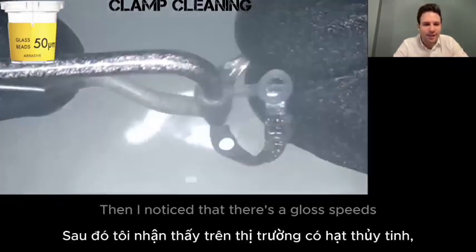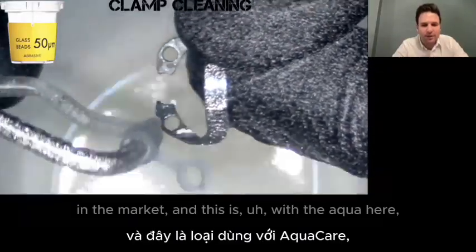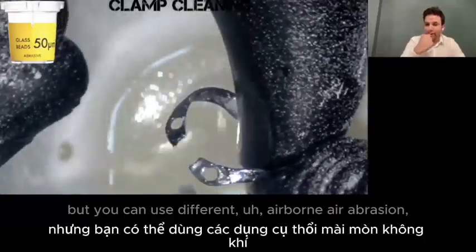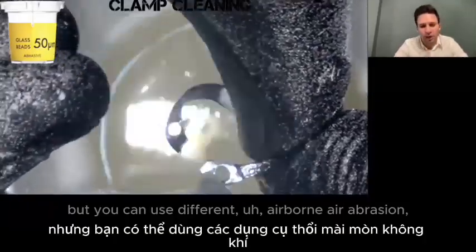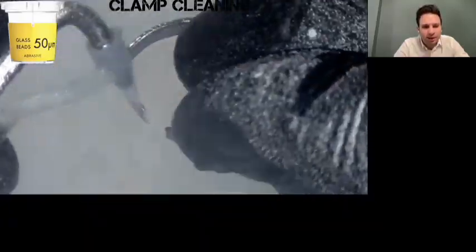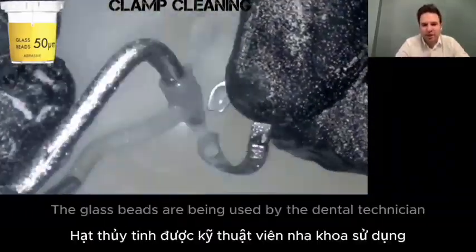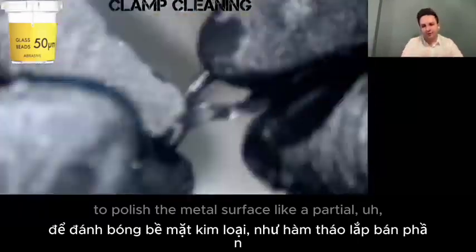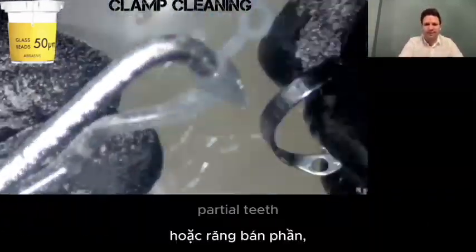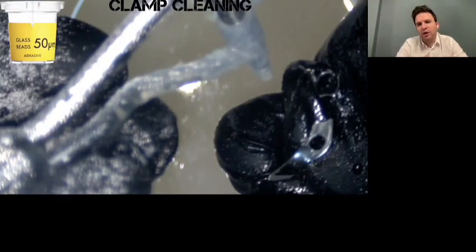Then I noticed that there are glass beads in the market, and this is with the AquaCare, but you can use different airborne air abrasion instruments. The glass beads are used by dental technicians to polish the metal surface, like partial dentures or inside the crowns.